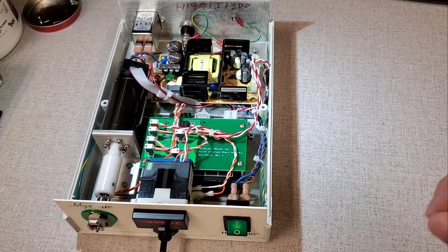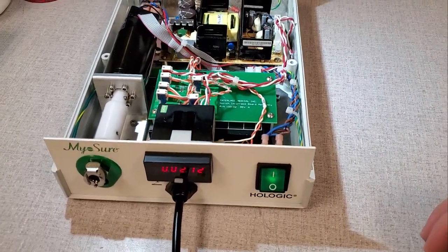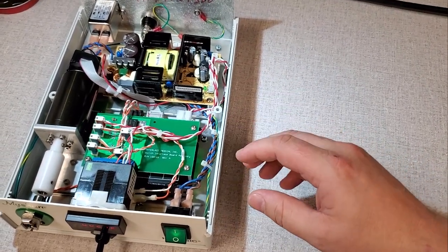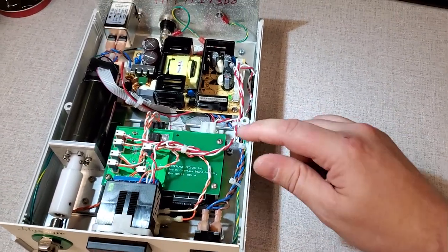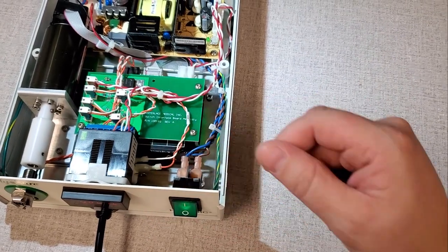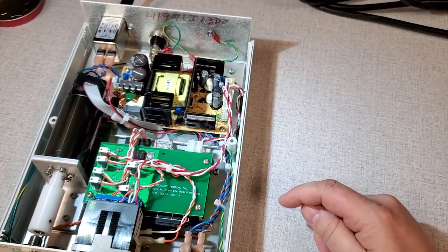Now, this next unit, this is a MyoSure. And this is used in GYN procedures in the operating room. The MyoSure has a servo motor. Down here is your servo controller. And this is just a regular power supply.